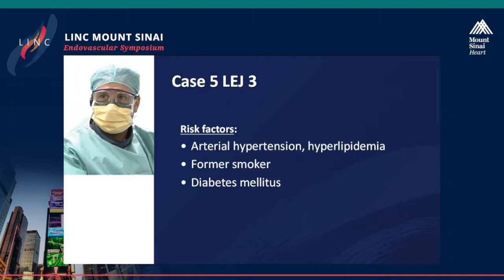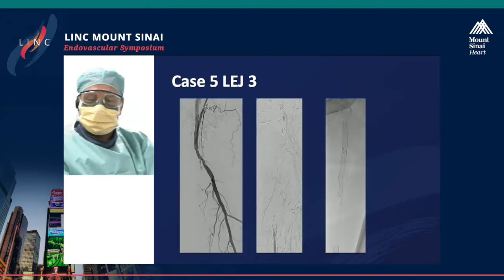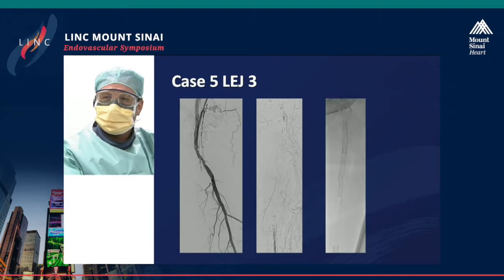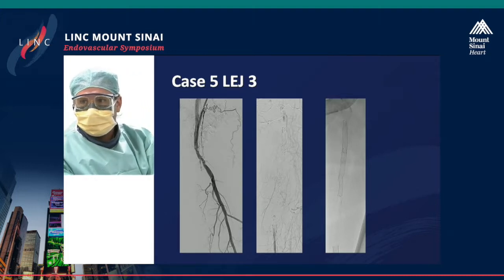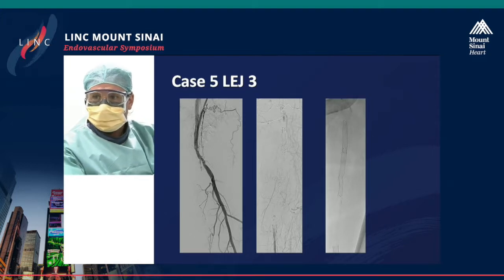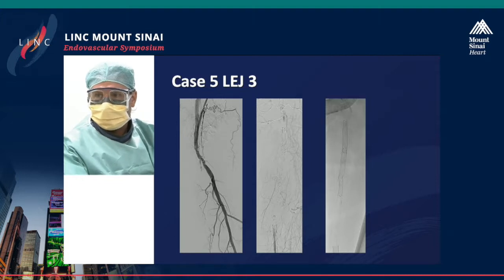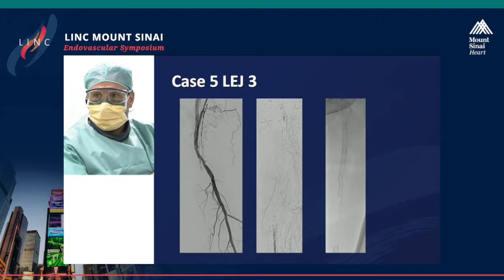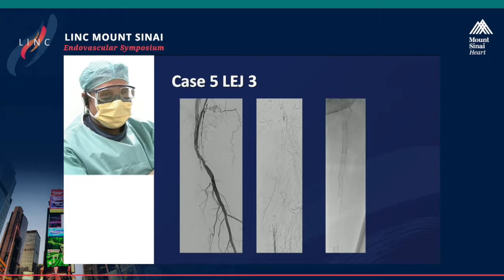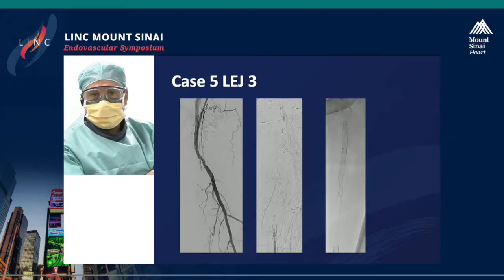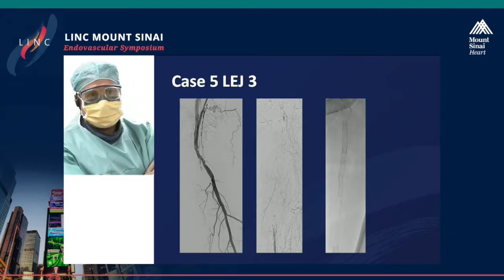This is the corresponding angiography. On the left side there's a little stump present of the SFA, but then a long occlusion in the stents and also between the stents. The distal stent at the level of the distal SFA is then filled again and is patent. Our strategy is a crossover approach to cross with a guidewire, then do some atherectomy or debulking with a laser catheter, followed by application of drug-coated balloons.